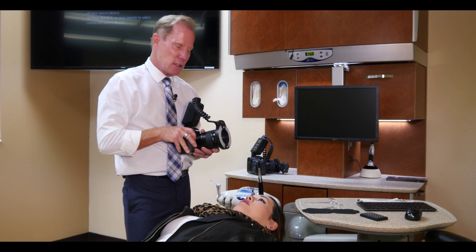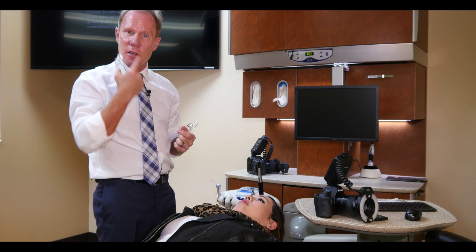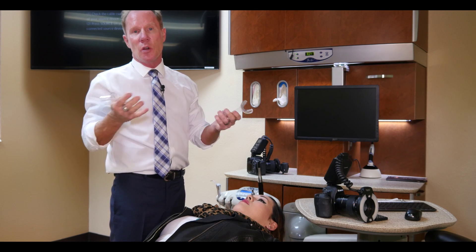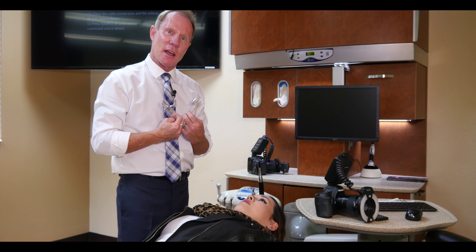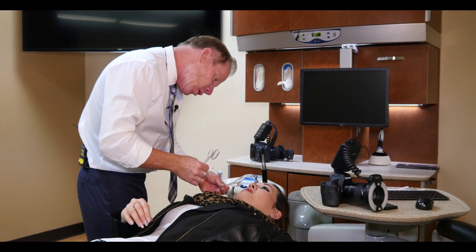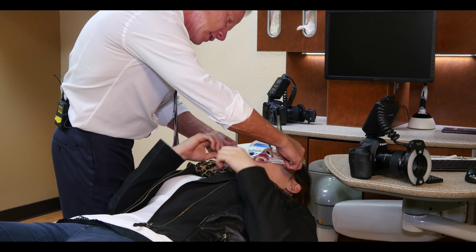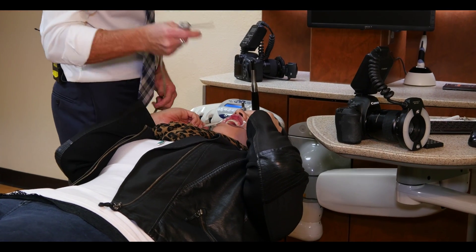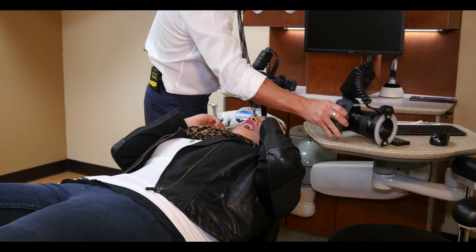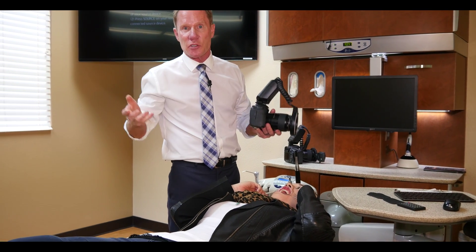Next we're going to take a retracted view. I like plastic cheek retractors versus metal — you get a little more exposure of all the teeth and you don't get that lip coming down in the center. These are available from numerous manufacturers and dental supply companies. What I like to do is put them in and have the patient hold them — they'll pull further than I will. I'm going to blow some air to get rid of those saliva bubbles, which gives a more professional look so we're not photoshopping it out later.